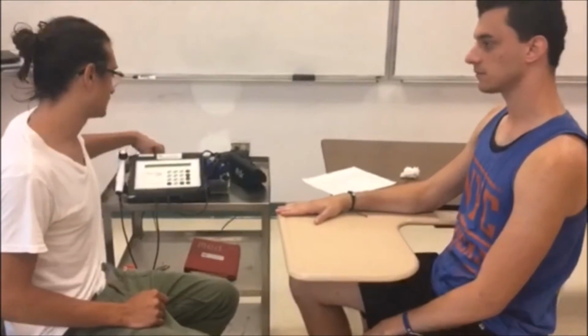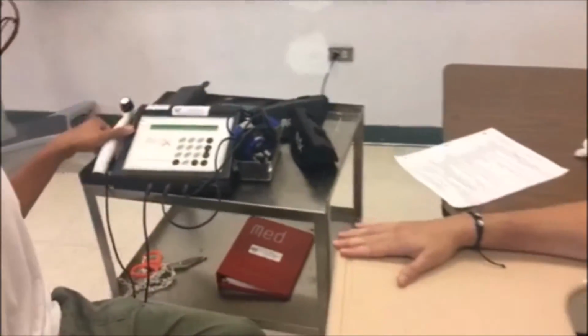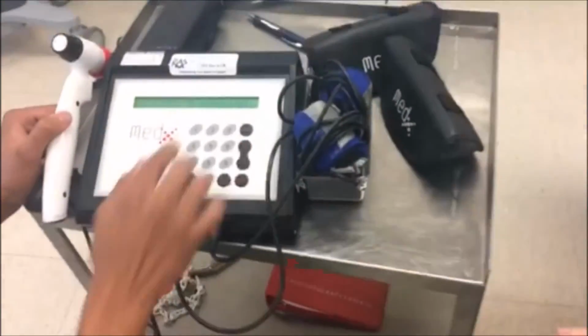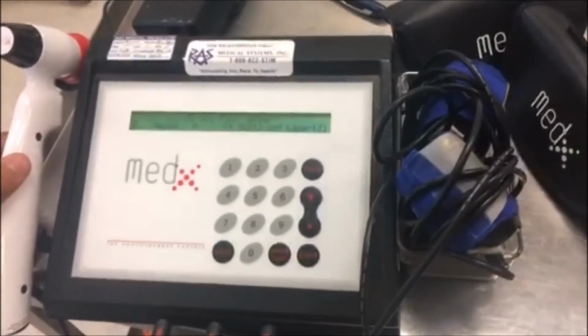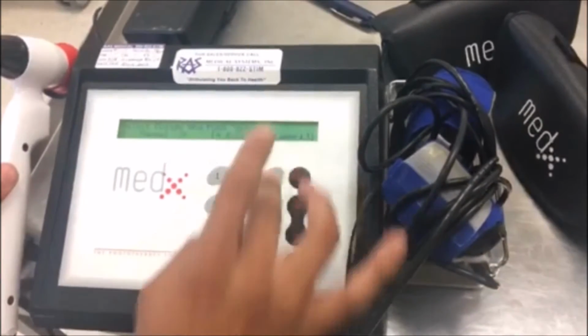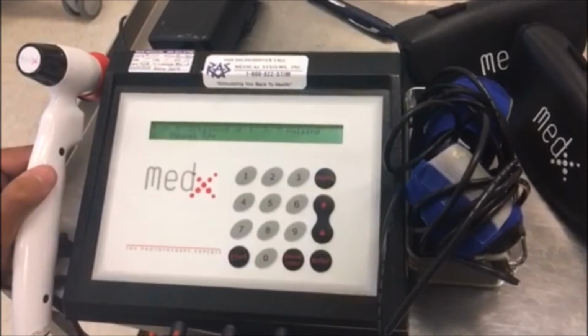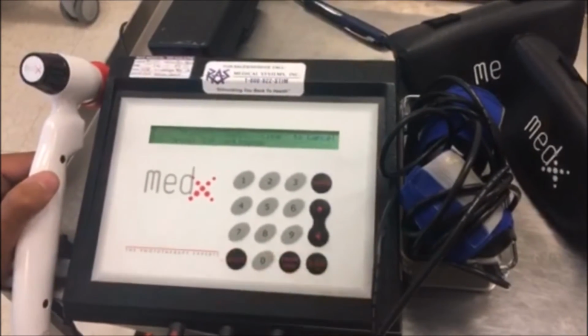Let's jump into treatment using the laser machine. I'm going to be treating Jason for rheumatoid arthritis in the right hand, and I'm turning on the machine. Now we're only going to be using laser, so I'm going to choose port 1, then press enter. For joules, I'm going to be using 3 joules just because it's the first treatment. I'm going to click enter. I'm going to be using continuous instead of pulse.